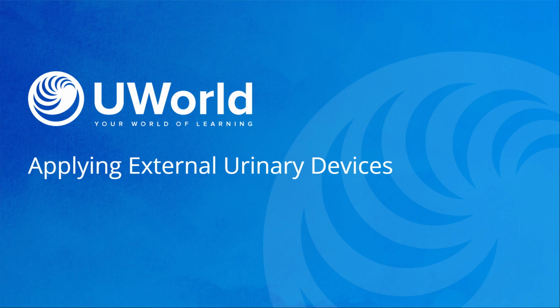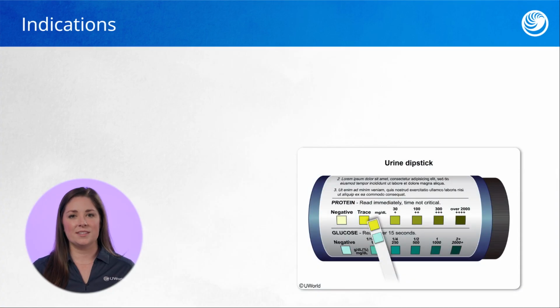This topic is applying external urinary devices. So let's talk about some of the reasons or indications that a client may need an external urinary device. One of the first indications would be if the client is experiencing urinary incontinence.